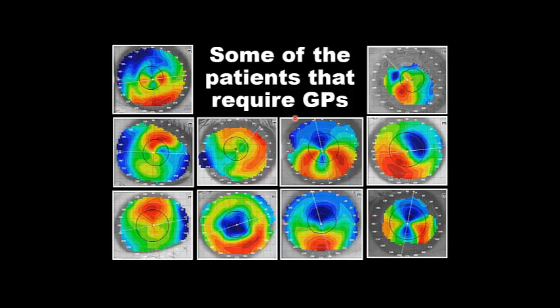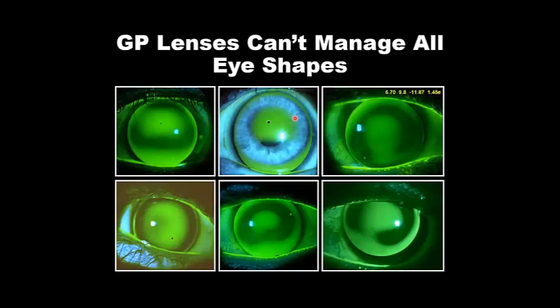The trouble is, with corneal GPs, we can't always achieve that optimal lens-to-cornea relationship. All of these fits you see would provide decent vision, but it would be comfort or fit that would be inadequate. And this is where scleral lenses really help.